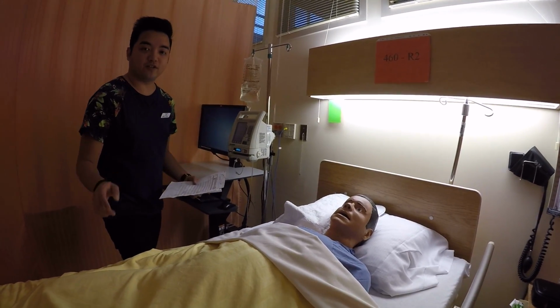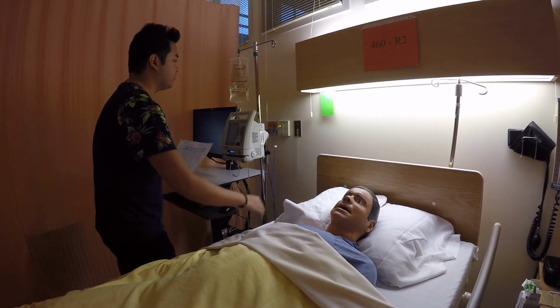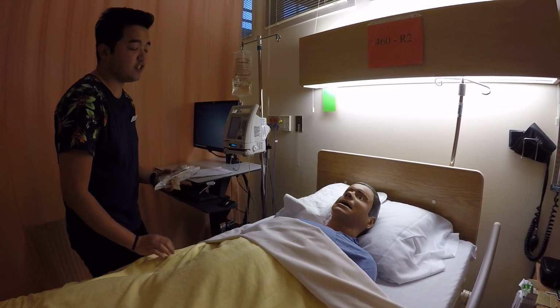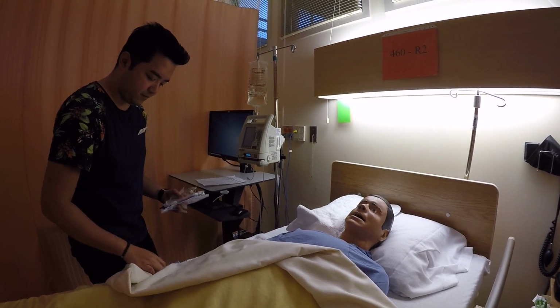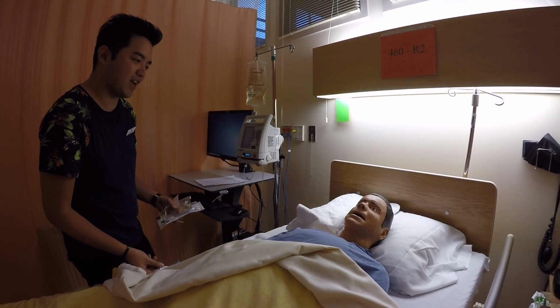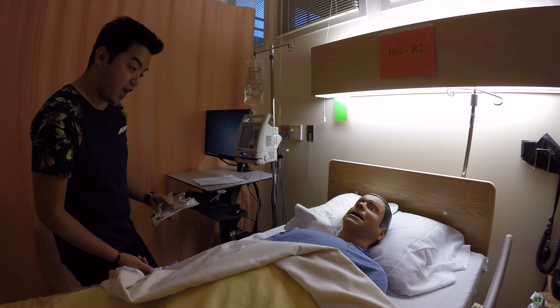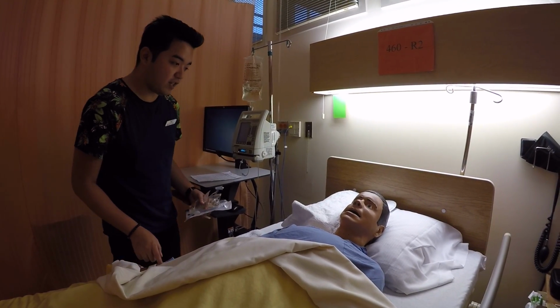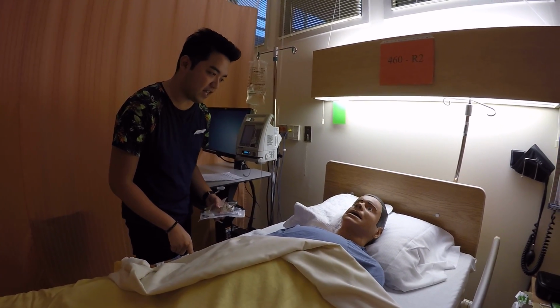And then just want to make sure that your side rails are up, and then your call bell is within reach. And then, okay, and then Mrs. De La Cruz, can I just check your armband? And for verification purposes, can you tell me your first and last name again, please? Thank you. And your date of birth? Okay, thank you. And then, now that I'm here, I'm also gonna be checking your IV site, okay?